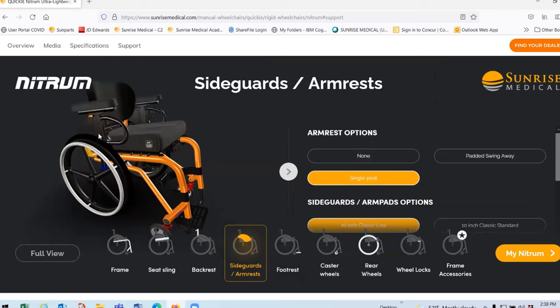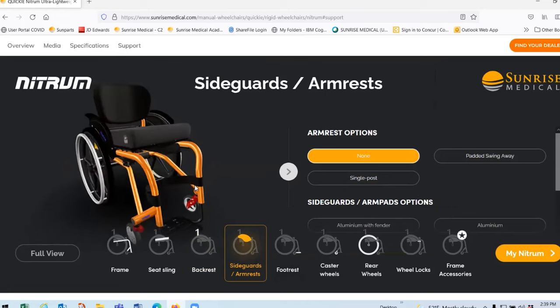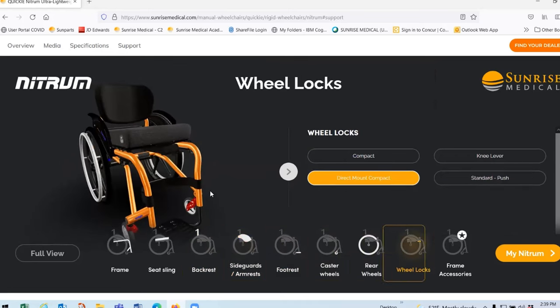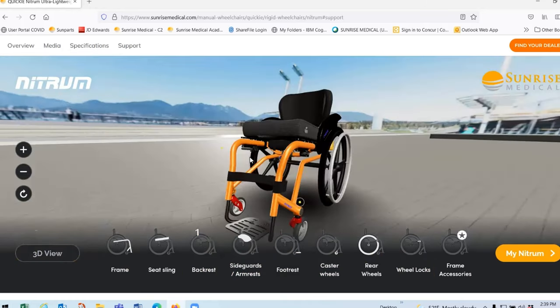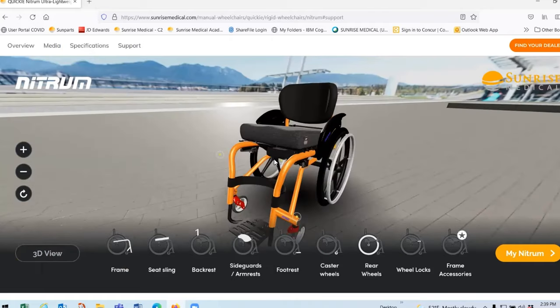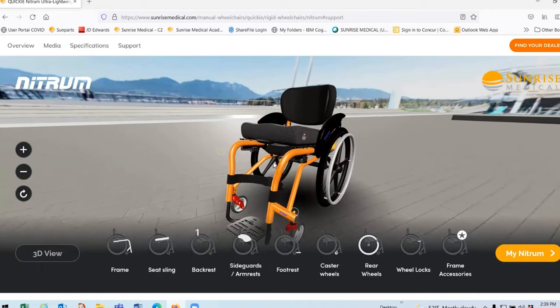All chairs from the Quickie portfolio are reimbursable under the K0005 HCPCS code. The website also features a 3D visualizer where you can configure and personalize your chair on screen. The user can configure their own Nitrum and, if they want, view it in their environment via augmented reality — making it the first to use this type of technology, particularly useful during the current pandemic situation.